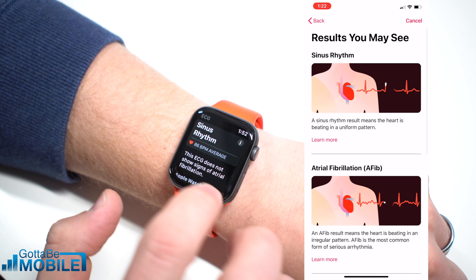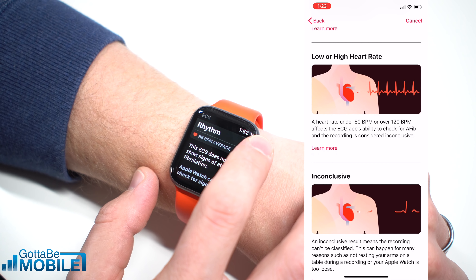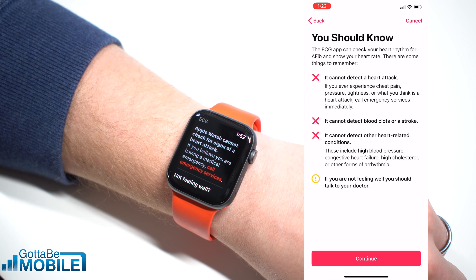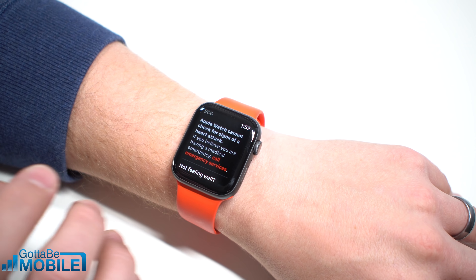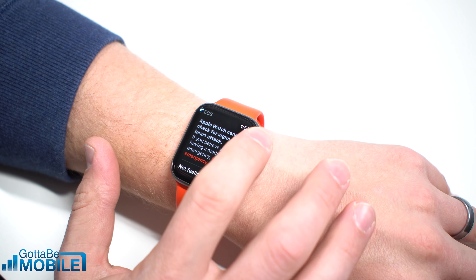So here you'll see my sinus rhythm. I have an 86 beat per minute average on my heart rate, and this ECG does not show signs of atrial fibrillation. You'll see a warning almost every time that you do this, where it says it cannot detect signs of a heart attack. So if you're having an emergency medical situation, call 911 or your local emergency services. Don't try and use the Apple Watch to diagnose that.